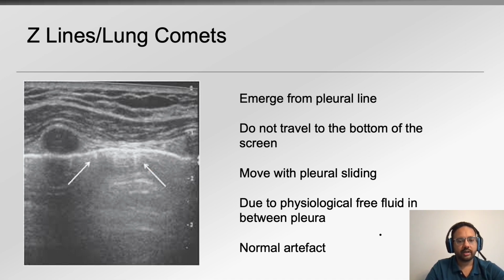So at this point, if you're listening to the video, I would take a second to pause, go back and review the artifacts that we talked about if you need to, and then right after that we will jump into diagnosing some pathologies and how to practically apply lung ultrasound to the bedside.